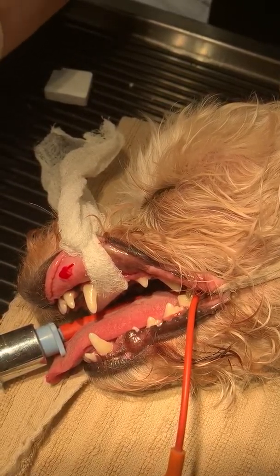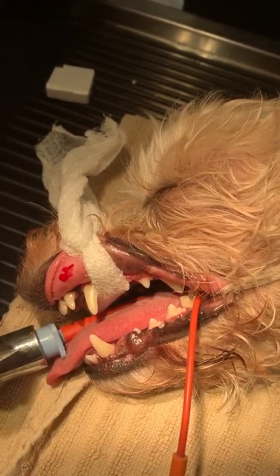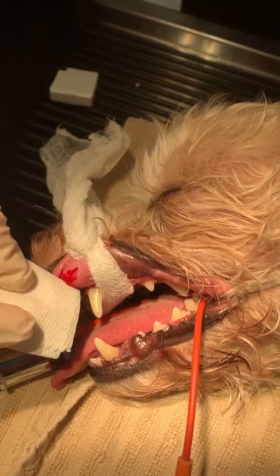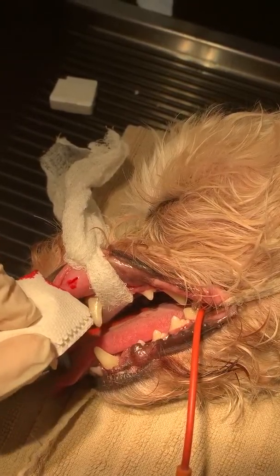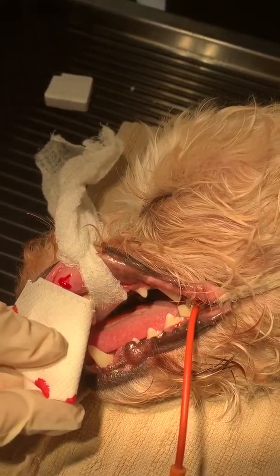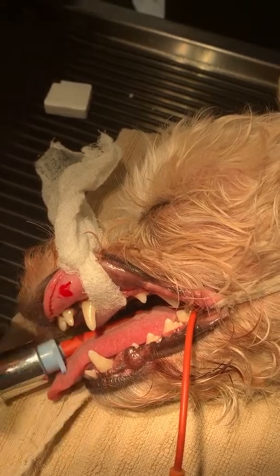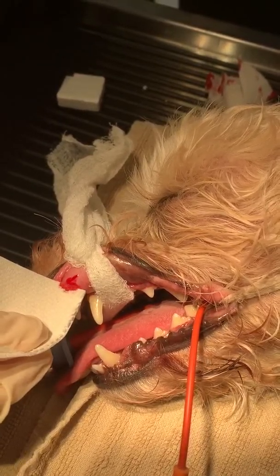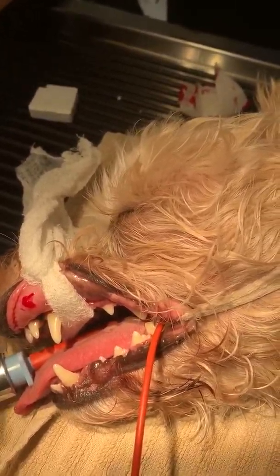So we'll just be patient and dab away every five seconds or so. I'm kind of doing it as it builds up because I don't really want it running down his mouth at all. It does already seem to be slowing down, but we'll go the whole way through so you can see the results. Here you can already see it's kind of slowing down throughout the three minute marker.